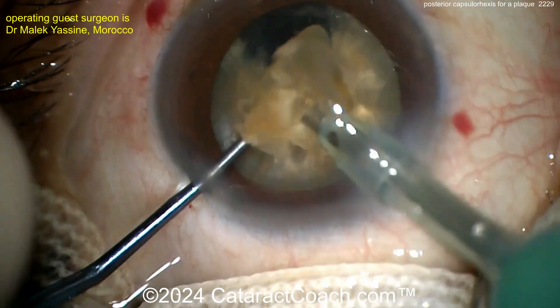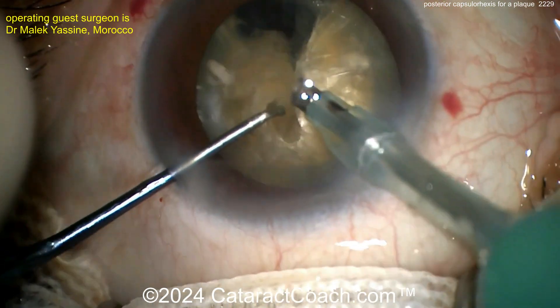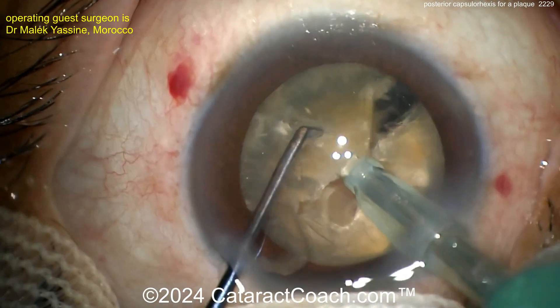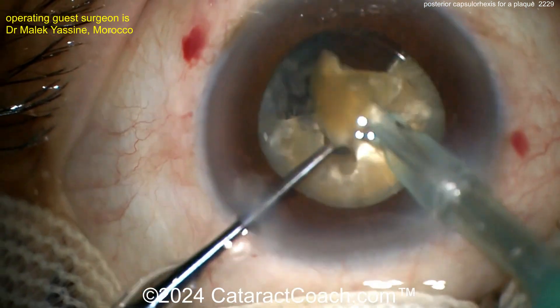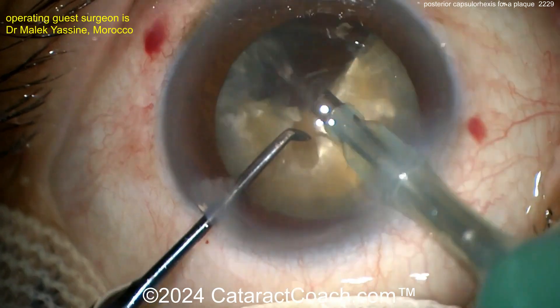Bring that one quadrant up to the iris plane. Emulsify, taking your time there. Nice keeping the eye in primary position. Good pivoting in the incisions. Buzz into the nucleus again. Chopper going around — maybe another sub-chop from that quarter. Split it in half into two-eighths, and now each of these can be removed pretty easily. Nicely done.